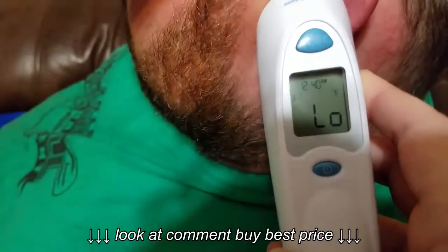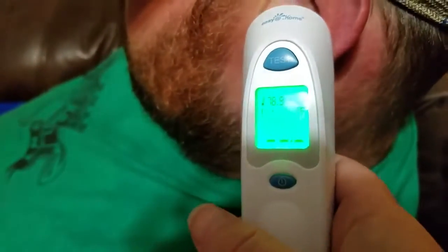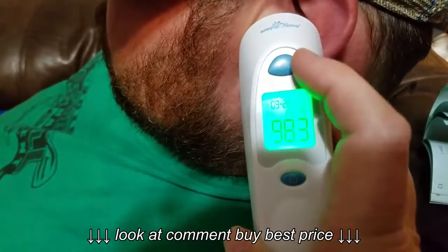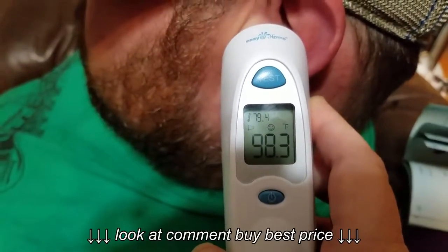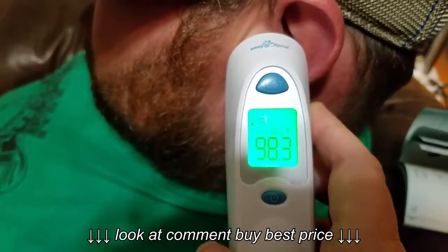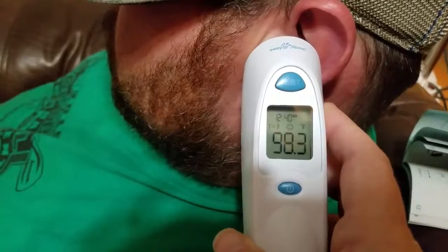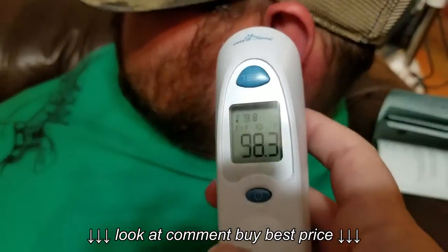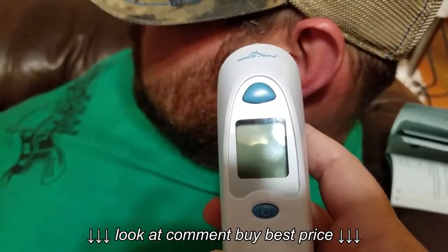Let's see here. And it says low, so I must not be doing something right here. Let's try again. We're going to go ahead and hit the test button again. Alright, so this time it worked. It was 98.3. It shows a little happy face. That means his temperature is in good range, so that's good. If it was in a bad range, there'd be a little sad face right next to that. And then you can remove it. It takes the temperature in literally a second, and then you can turn it off and you're all done.